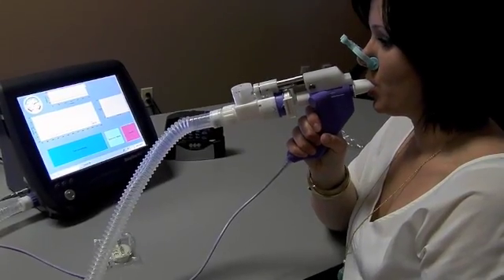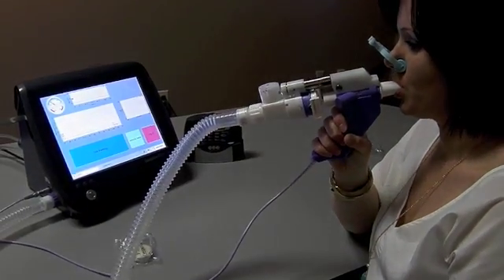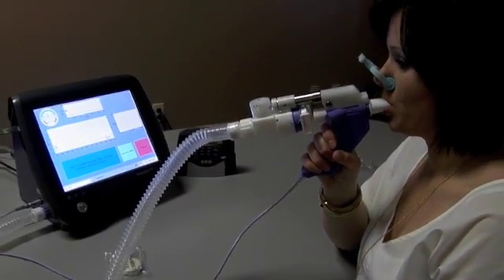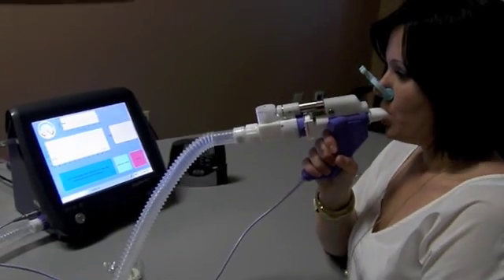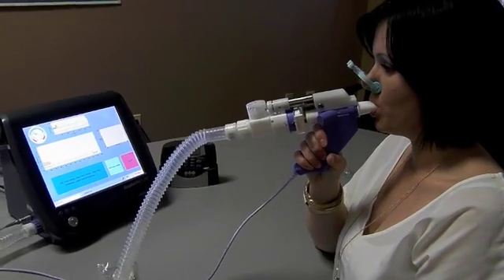So for this part of the phase, we just continue doing tidal breathing and we have this machine set up to do a linked maneuver, so now she's going to perform a slow vital capacity, taking a deep, slow breath.